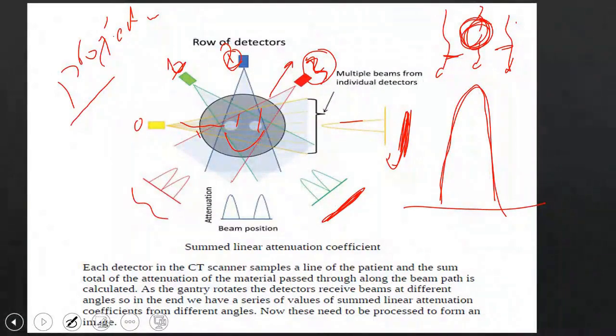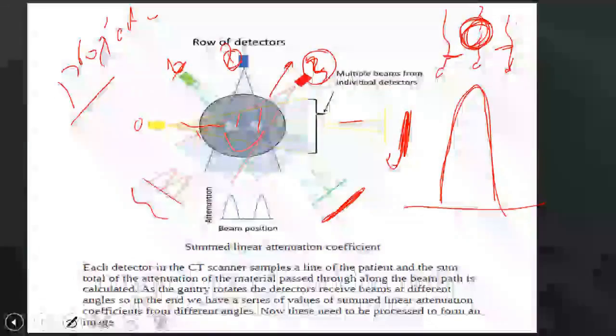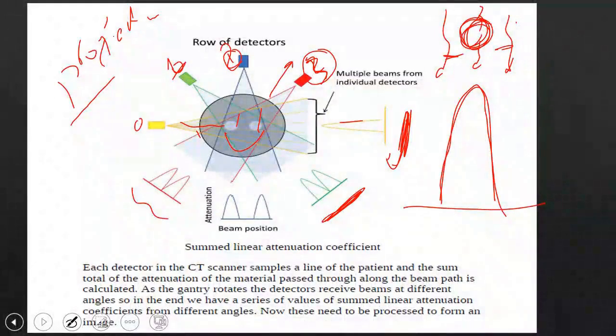Now where should this data go, doctors? It should be placed correctly. In the end, where do I want it to go? What do I want to extract in the end? The image. I want to take everything I have taken and return it again to the image, so it will be called reconstruction.